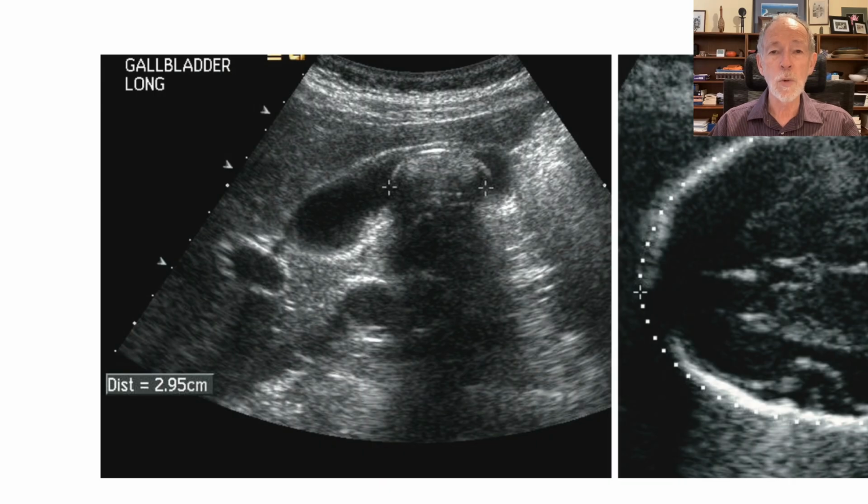If you were to get 2 or more individuals to measure the same structure, they might well come up with significantly different answers because of this subjectivity. So this is a significant limitation of ultrasound measurements. The machine can compute the measurement with great accuracy. You can see it's displaying it to 2 decimal places. But it's very likely that there's an error of at least 5% in making this measurement because of the fact that it's a matter of judgment, just where you place the measurement markers.